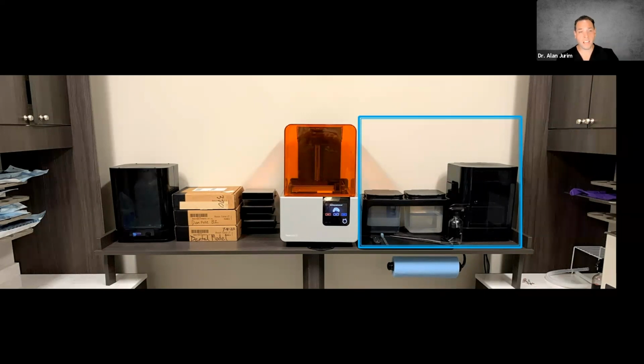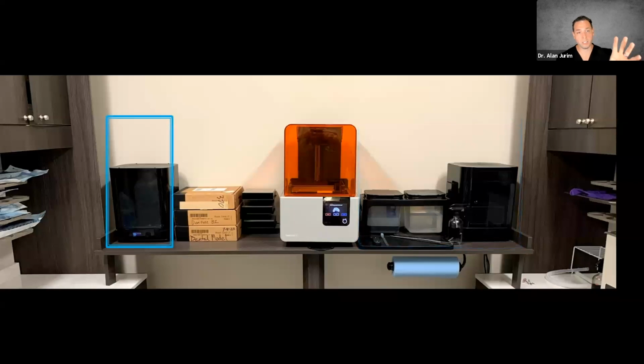And then once that part is done, notice the right-hand side of the printer is where we'll be working with the model before it's really clean. But once the model has been cleaned, then it moves over to the left-hand side where we have our Form Cure. It will go in there and be processed with the right settings. And once it's out of there, now it's ready for assembly or for whatever post-processing finishing it may need.